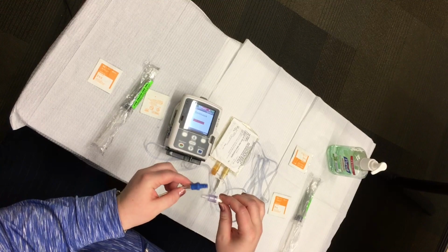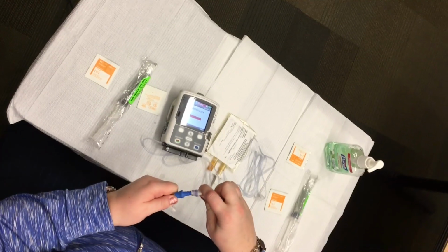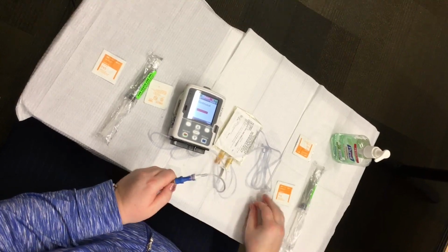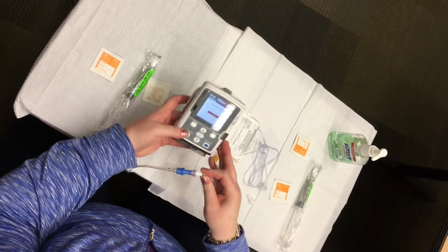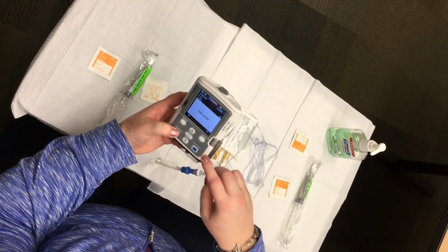Connect the infusion to the clave as directed by your Providence RN and press the start-stop button. The pump will ask you if you want to start. Press the white button under yes.